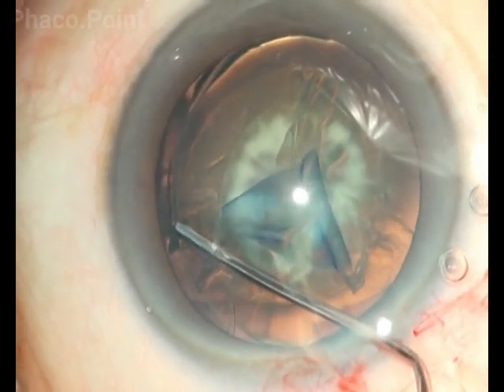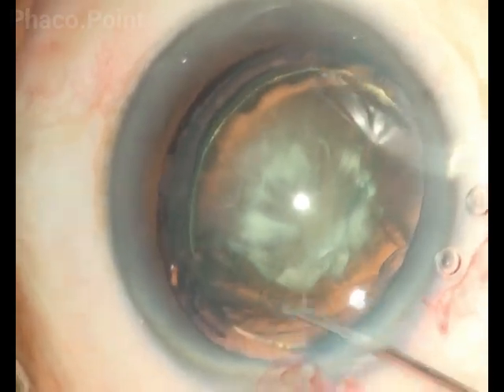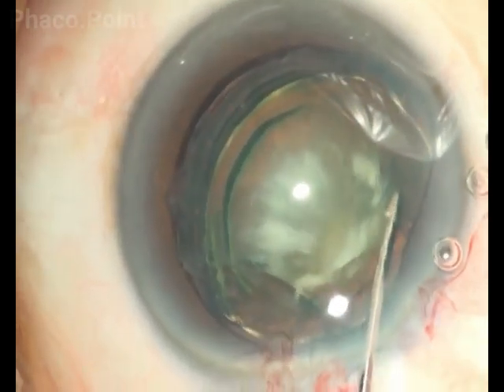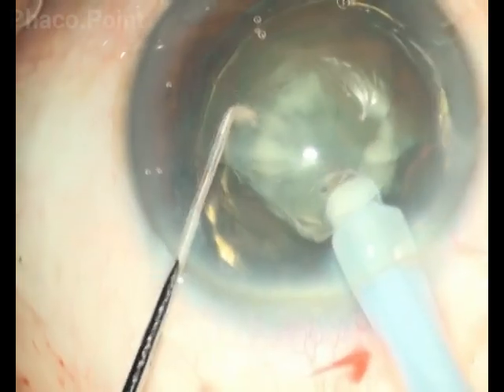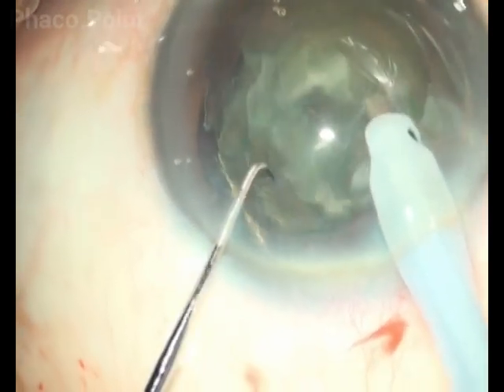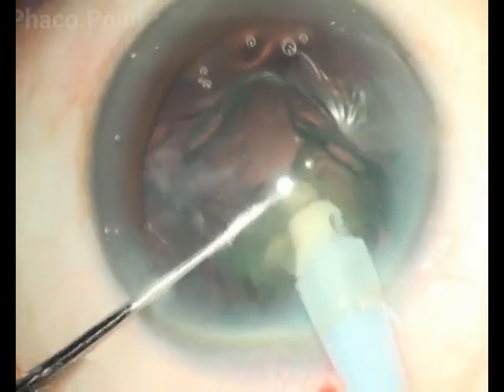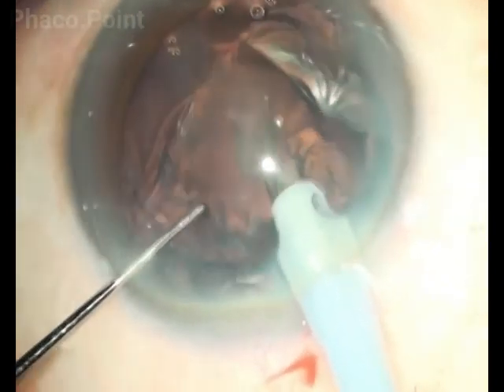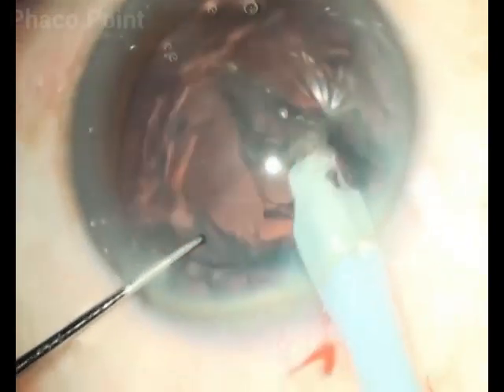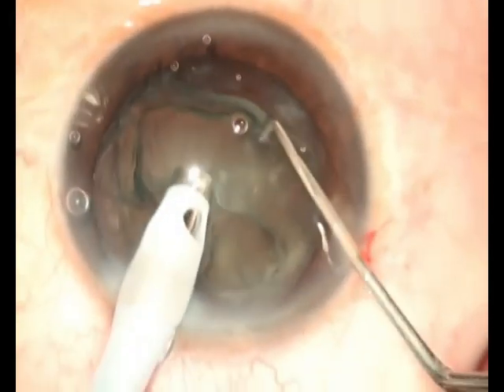Please note how the surgeon, with care and caution, performs a very careful cortical cleavage hydrodissection resulting in the prolapse of one pole of this very soft nucleus. Having achieved that prolapse, the surgeon just holds on to the elevated pole of the nucleus, downsizes, and emulsifies the entire nucleus. The points to note — which you will see in this surgery and in the following surgery — is that even though you are working on a nucleus that is prolapsed, we are almost using no energy in emulsifying this nucleus.